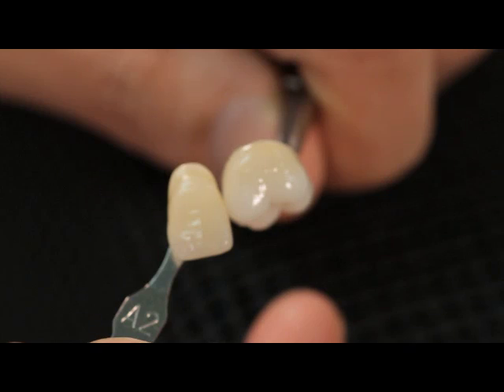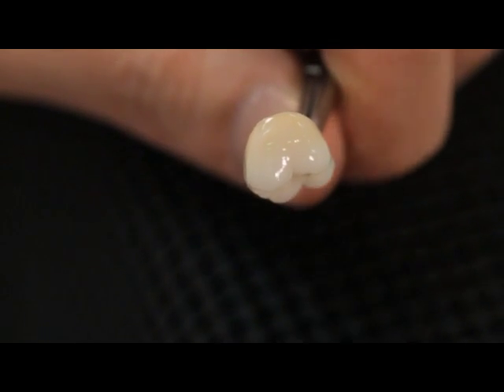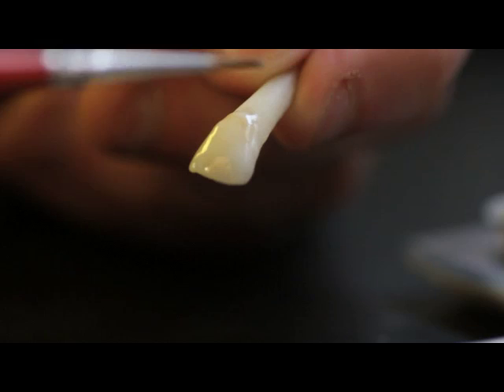Due to the unique properties, it takes a matter of minutes to individualize the surfaces of your crown and bridge work — to paint on white fans, decalcifications, hair lines and crack lines, or to characterize your restorations.